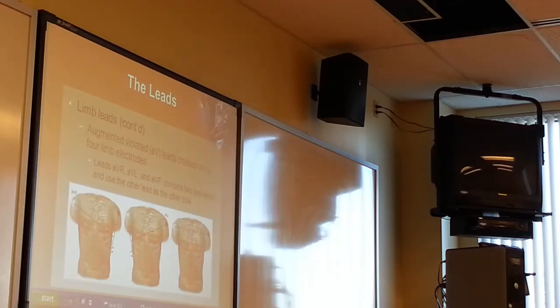So, are you saying we should move the leads for a 12 lead to the wrist? Well, you're getting a better capture if you go further down. For me, because I get seen by a cardiologist every 6 months, I have them down here. The further down you are, the better the capture. And that's what you're taught in the 12-lead EKG interpretation course, where they talk about how to place the leads on your body.